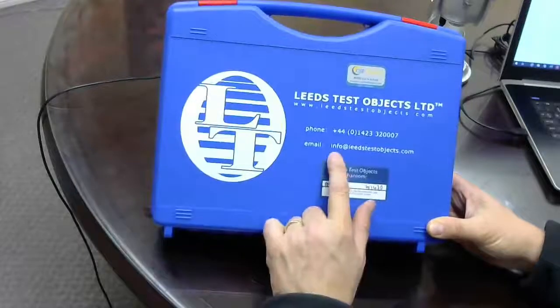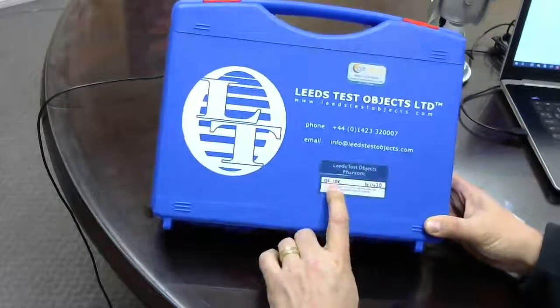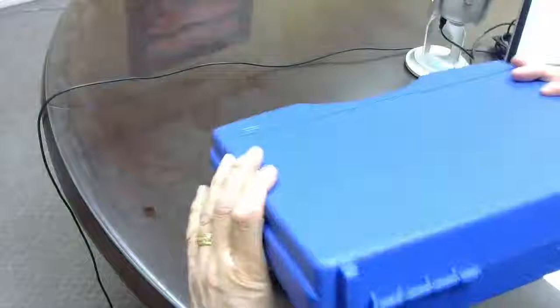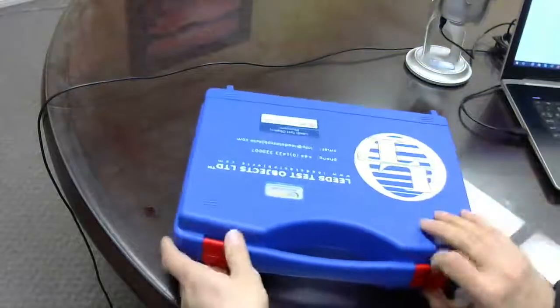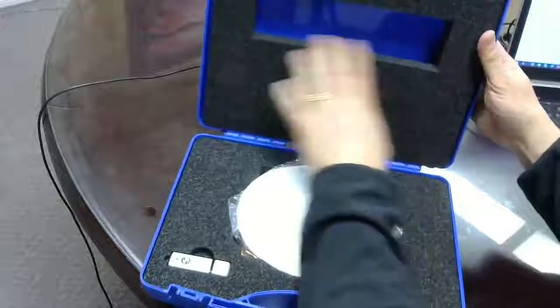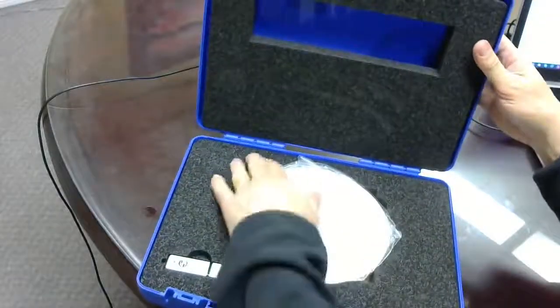This particular item is a TORS CDR, so it's an imaging test object, and as you can see it comes in a nice compact case. It's a plastic case with foam insert, so it's very well protected.